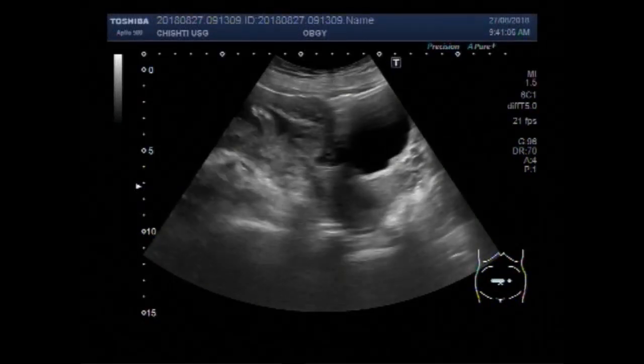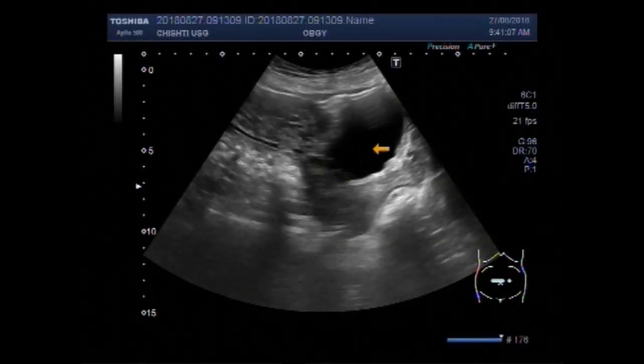Dear viewers, I hope you are all fine. This ultrasound video shows a fetus having a large encephalocele.